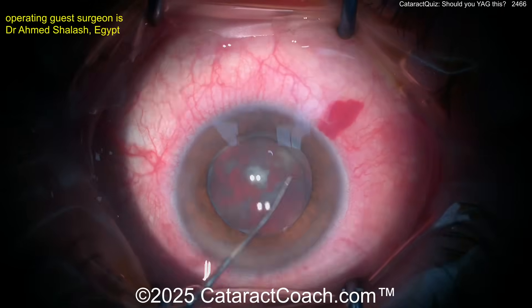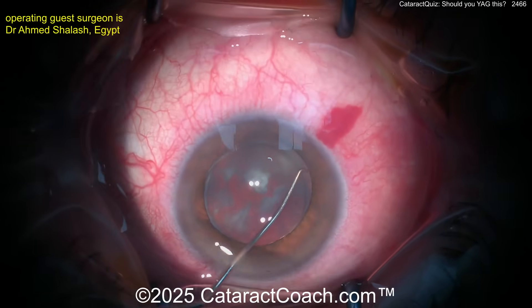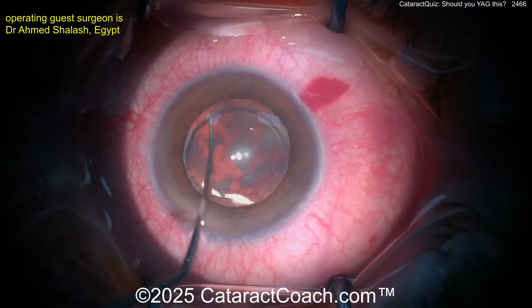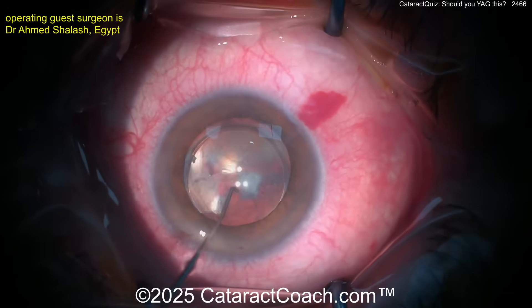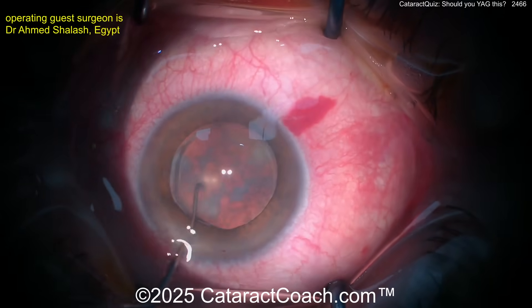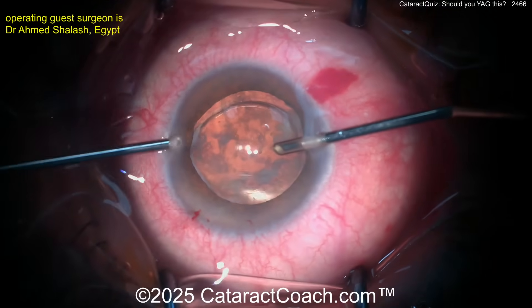Can you go behind there and aspirate out that material? Slowly dissecting away the IOL from the capsular bag. If needed, you could do an IOL exchange, but let's say you don't need a lens exchange — the lens is the appropriate power, the optic looks clear, there's no opacification of the optic. Trying to loosen it up a little bit — you can see some of that lens material behind the optic kind of leaking forwards.